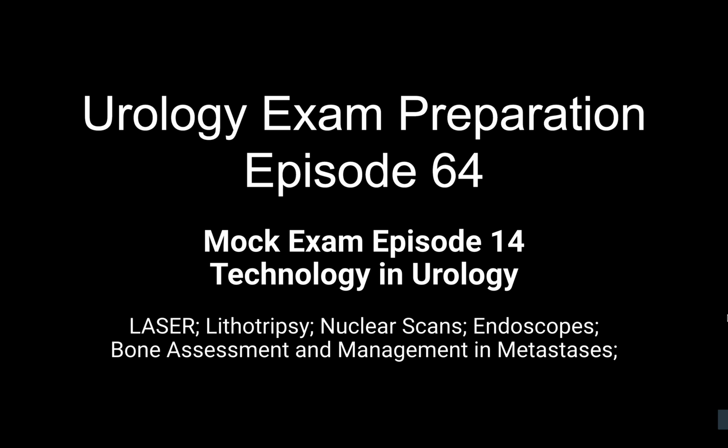Okay. Is there any newer technology available in the holmium laser you are aware of? Yes, there is something called Moses 2 technology, which uses a double plasma, double bubble effect. Basically, it creates one bubble, and then that creates another bubble, leading to destruction of the stone. This way, we can stay a bit away from the stone and still manage to break it. What may be the advantage of Moses compared to non-Moses holmium? It allows better visualization and better stone clearance as well.